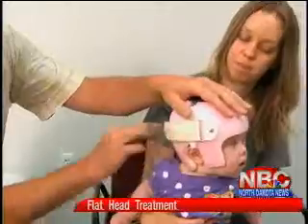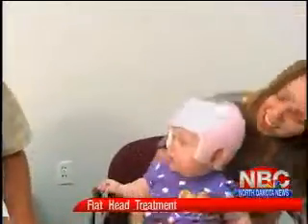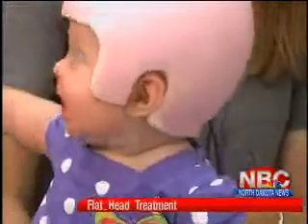Ivy wears her helmet 23 hours a day, only taking it off to eat and have a bath. But her big pretty smile suggests she doesn't really mind.